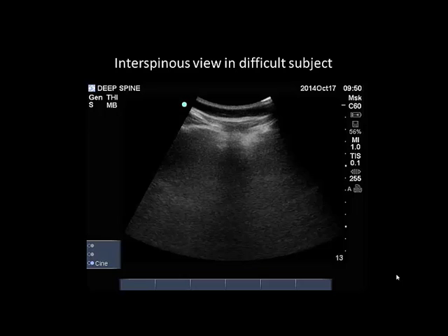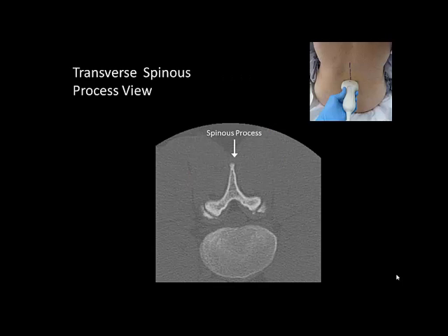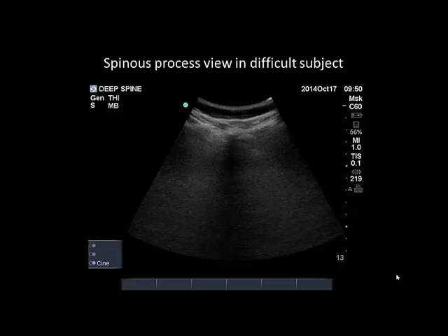In patients with challenging anatomy such as morbid obesity or narrowed interspinous spaces, it is not always possible to obtain an adequate interspinous view. In contrast, the spinous process and the adjacent laminae are easily recognizable by the dense acoustic shadow that they cast on ultrasound. This is true even in very obese individuals, in whom the spinous process is identifiable on ultrasound as a vertical acoustic shadow with a hyperechoic apex at its most superficial aspect.